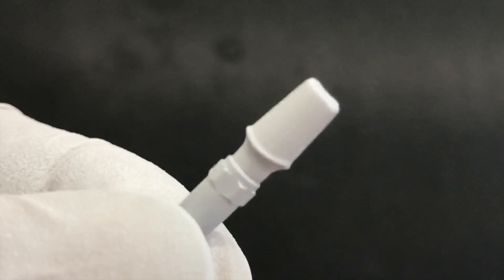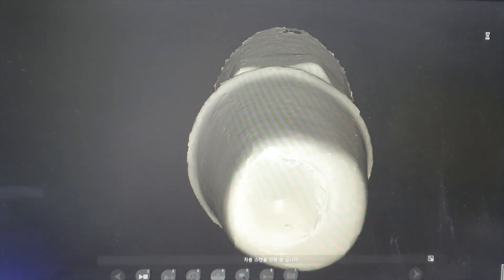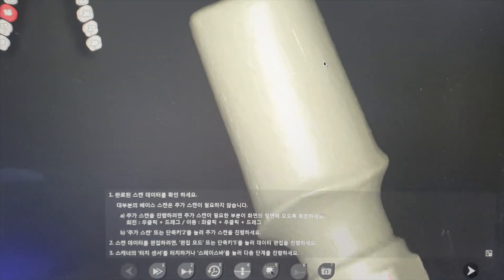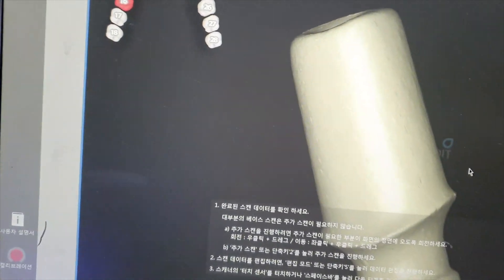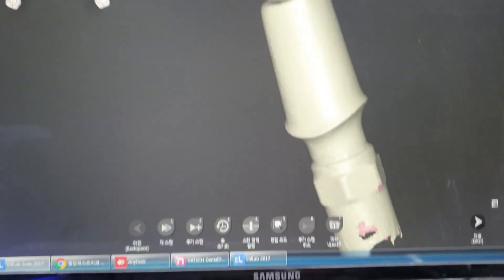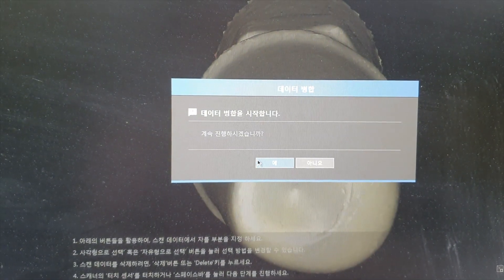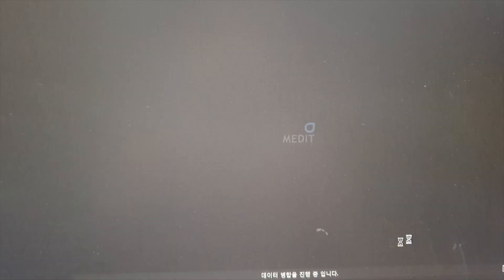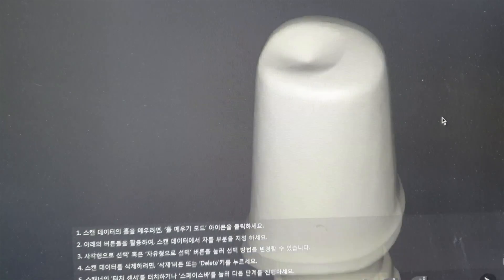I'll show you my way. And this is the result from my way, what I told you. Let's scan. Did you find some bumpy areas? I think we have better quality than the result from the other way. Take out the original data and run auto calibration. Now we've got our final scan data, right?